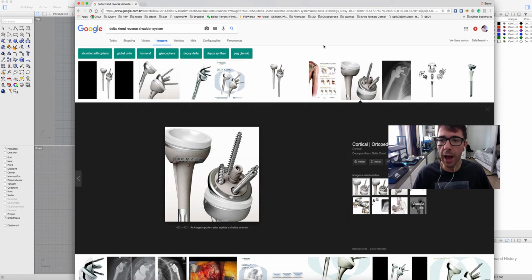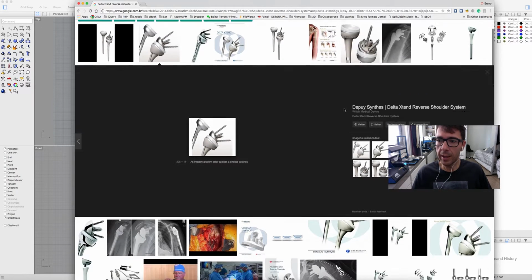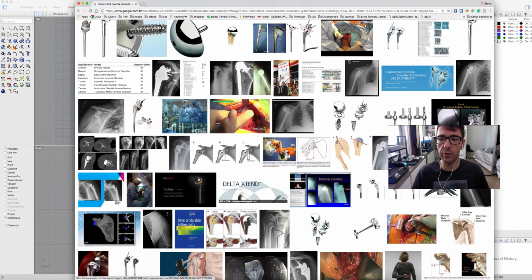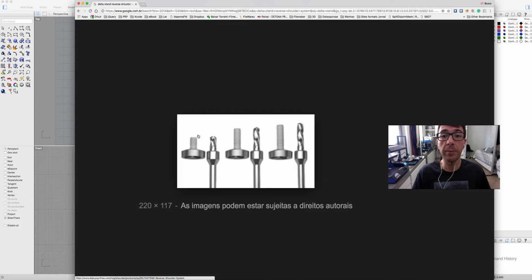This is a half sphere, as you can see here. It's a cylinder that corresponds to the central peg, four other cylinders that are the screws, and a cylinder that is the base plate. So this is what we are going to transform into a 3D file. In this picture we can see it easily. We have here the base plate, the normal and the extended base plate. So we are going to design this cylinder right here, which is actually the base plate, the central cylinder, which is the peg, and the screws.